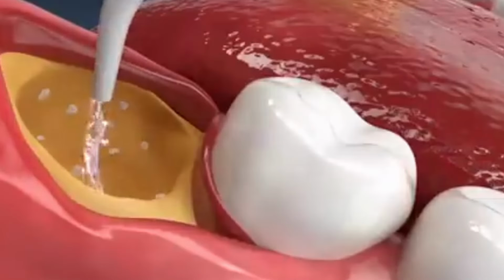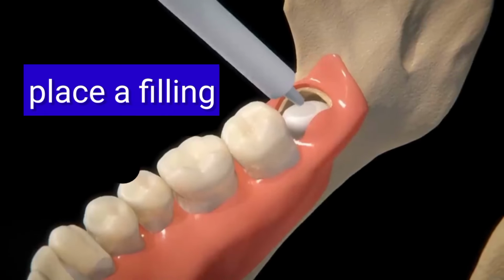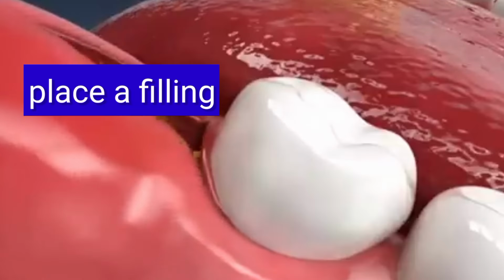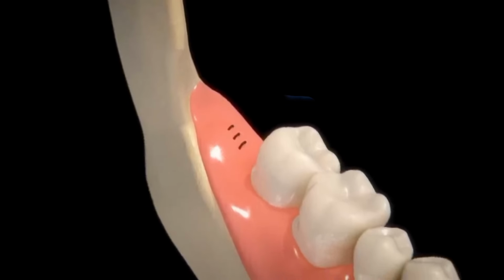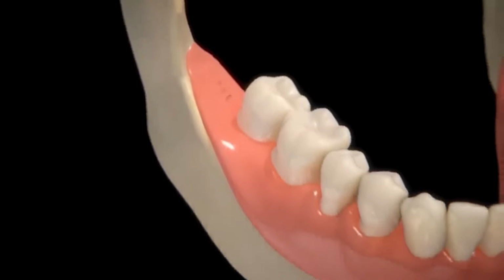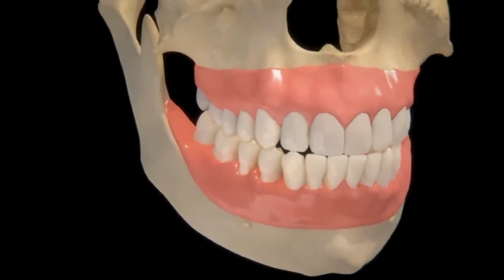Once the tooth is out, the dentist may clean the area and possibly place a filling to prevent infection. In some cases, they'll stitch the wound, with stitches usually removed about a week later. Full healing of the bone and tissue, however, can take around a few months.